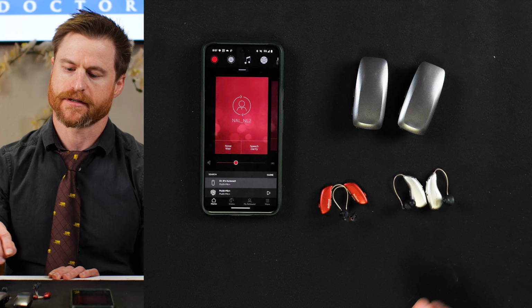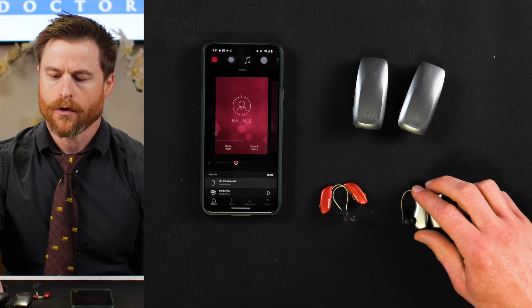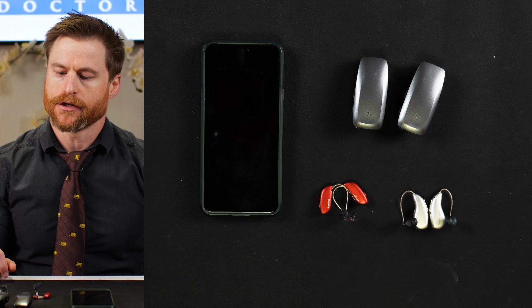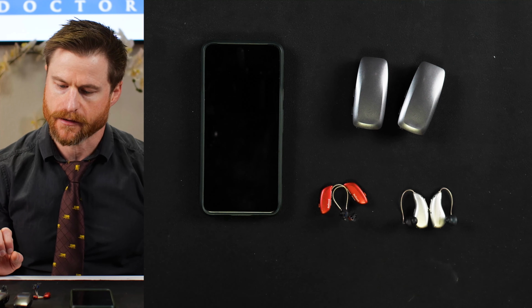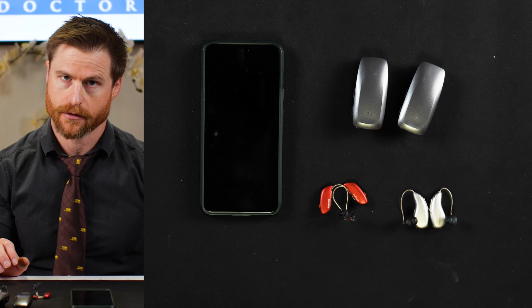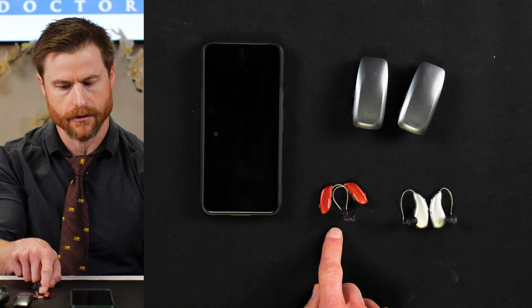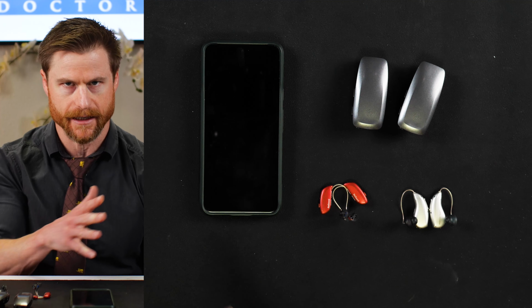So let's talk about the top 3 things first that the Phonak Infinio Sphere does really well. If you are into, right now, high fidelity audio streaming, you are going to want to be using the Phonak devices because they use classic Bluetooth, which right now is more stable compared to the new cutting-edge Bluetooth that ReSound and a couple other hearing aid manufacturers are getting into.